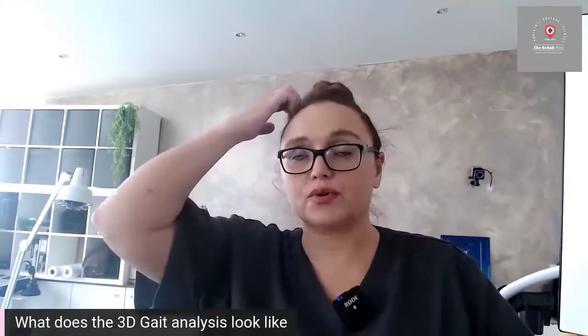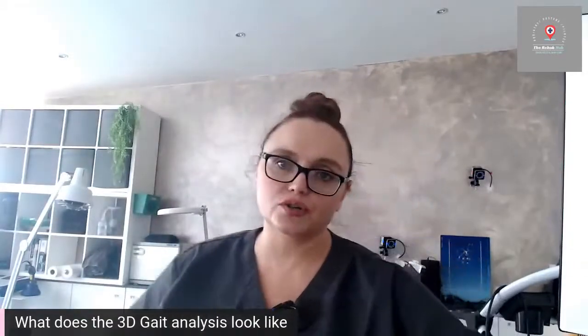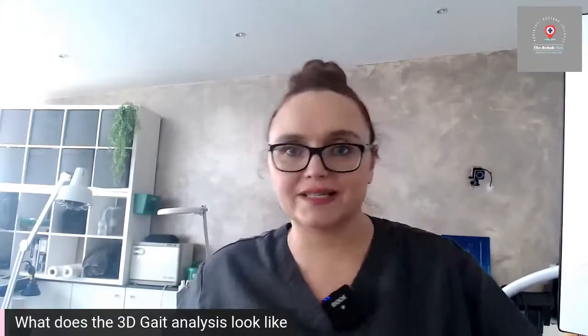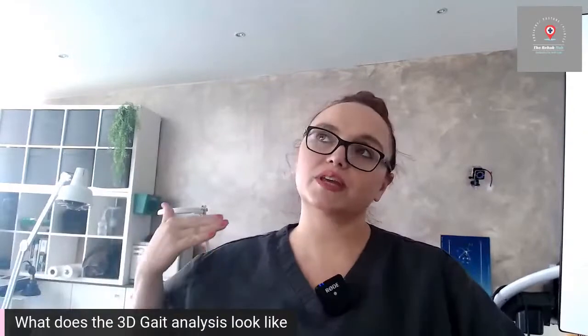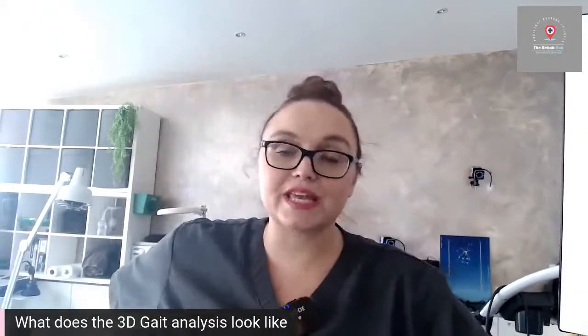Until we've analysed you, we won't know. So is it your stride length? Is it your cadence? Is it your speed? Is it what your feet are doing? Is it what your hips are doing? Is it strength somewhere? Are your hips not getting enough extension? Have you got too much extension? Is it your lower back? What is it? And then in real time we can get you linked up to the system and do gait retraining with you.